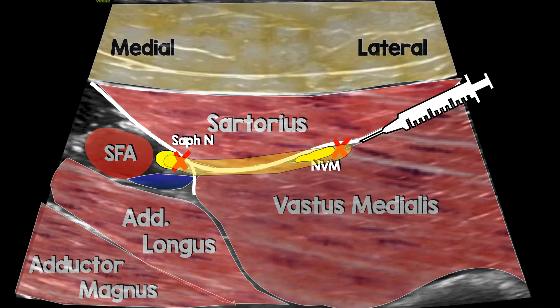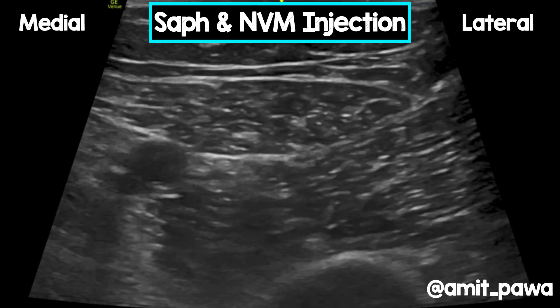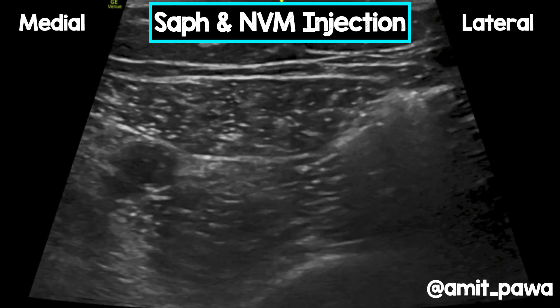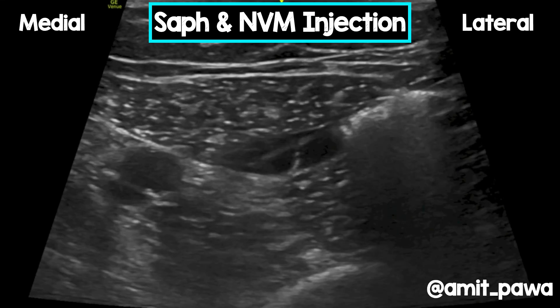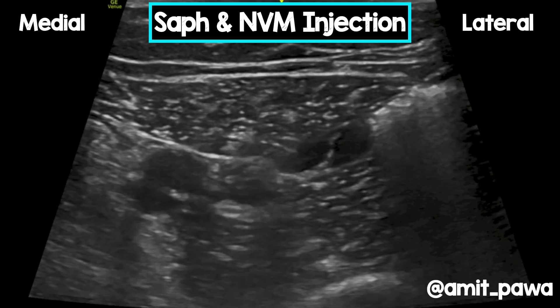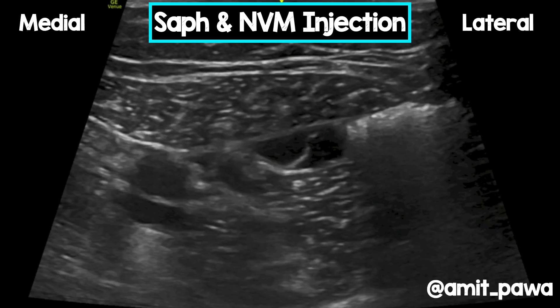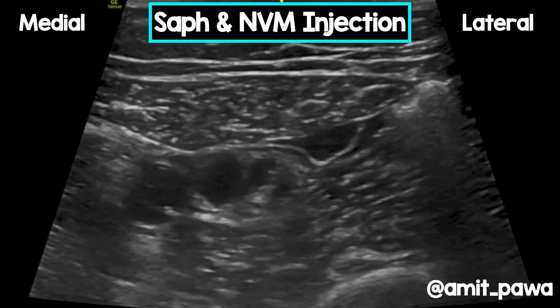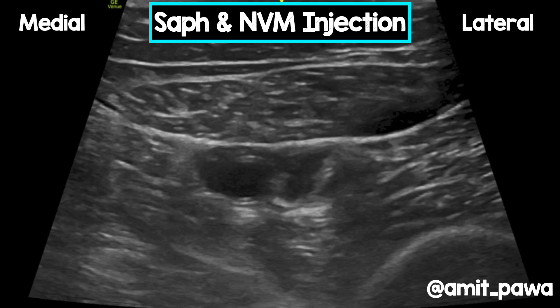Here's what that looks like in reality. You're going to see a needle coming in from the right side of the screen, popping through sartorius and vastus medialis. As we inject local anesthetic, you can see the needle tip hydrodissecting our path approaching the nerve to vastus medialis and opening up that space. Then we pop through the vastoadductor membrane to reach the saphenous nerve and inject local anesthetic around it. Popping over the superficial femoral artery — you can see the vein deep to it — as we inject, the artery is squashed down, confirming we're deep to the vastoadductor membrane. Now we can see the nerve to vastus medialis and the saphenous nerve as two separate nerves in two separate compartments.